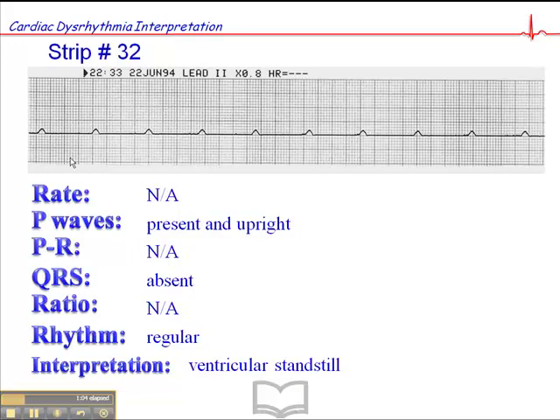Now, if you ever saw a patient with just P-waves like this, your first reaction would probably be, what is going on here? But the good news is this is not quite like asystole. Asystole can be a patient who's been dead for five minutes or for several days, whereas someone who has ventricular standstill with P-waves is probably someone who developed a third-degree AV block but no compensatory focus down in the ventricles took over pacing of the heart. So they went into cardiac arrest, into a ventricular standstill. When you see P-waves, it means it's a fairly fresh cardiac arrest.